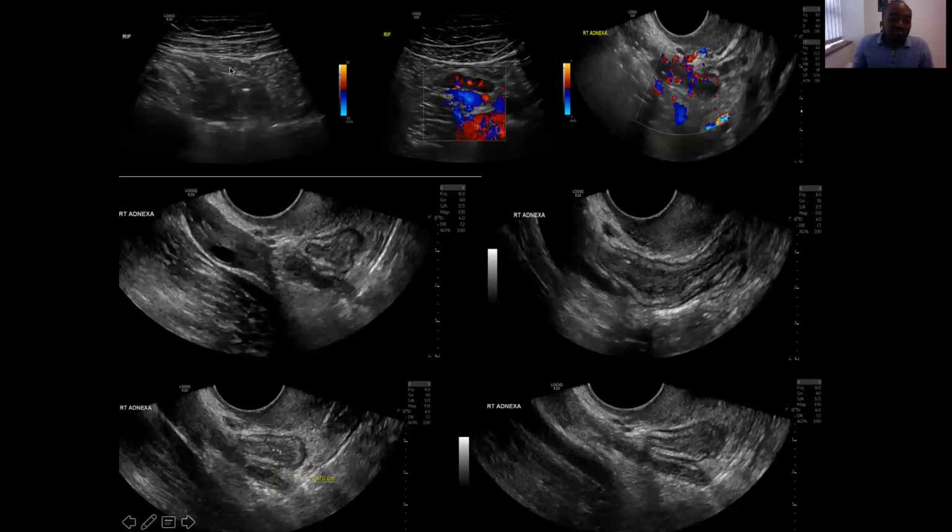You can see a bit of dullness around this right iliac fossa. You can't really see much going on. And then we could see the reactive lymph node there. That's the iliac vessels there. And then we did a transvaginal ultrasound, which revealed hypervascularity, a hyperemic bowel loop there, blind ending, tubular, non-compressible. And during sonopalpation, the patient told me it was tender.